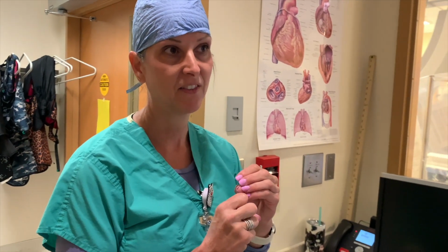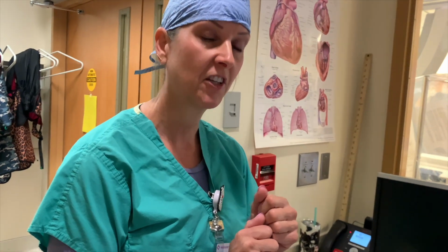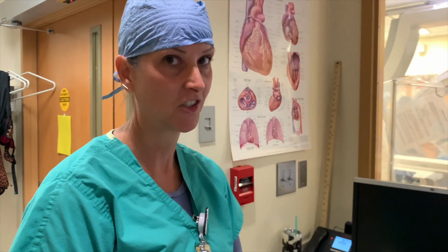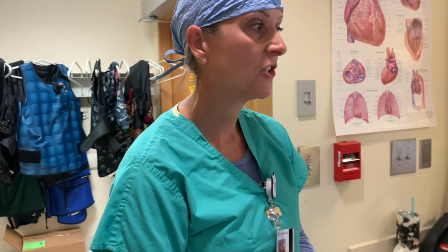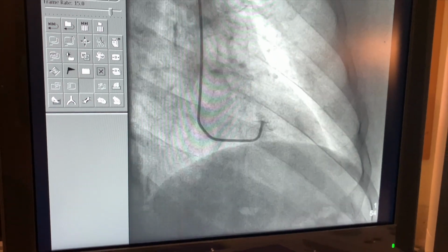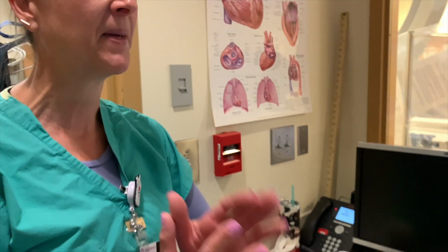Most people think it's the squeezing function, or that their heart isn't filling, and that isn't the case. It's that the heart muscle isn't being fed with its own supply of oxygen and blood. So here in a second, once he gets engaged, we'll inject contrast, which is what makes it look dark, and then we'll be able to see what's open and what isn't. That's how we decide whether the patient needs stents, or if they have multiple vessels that are blocked, they go to open heart.